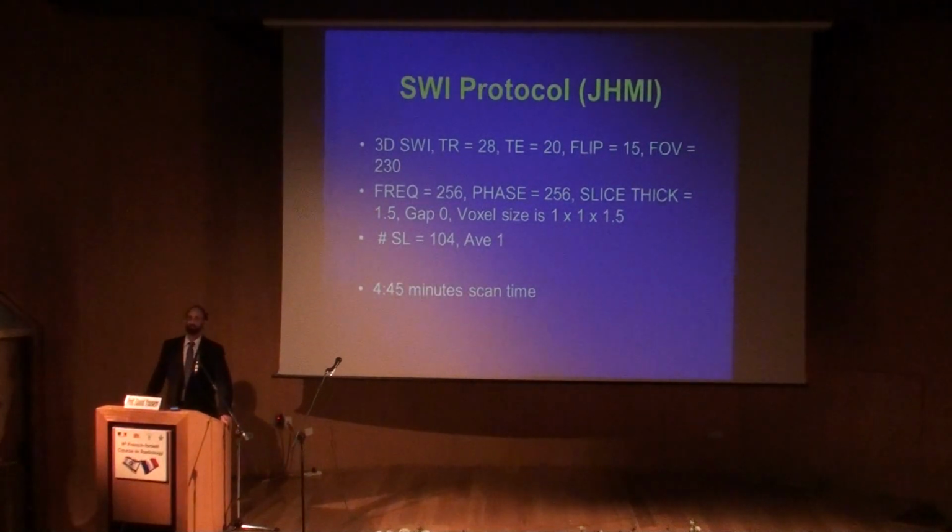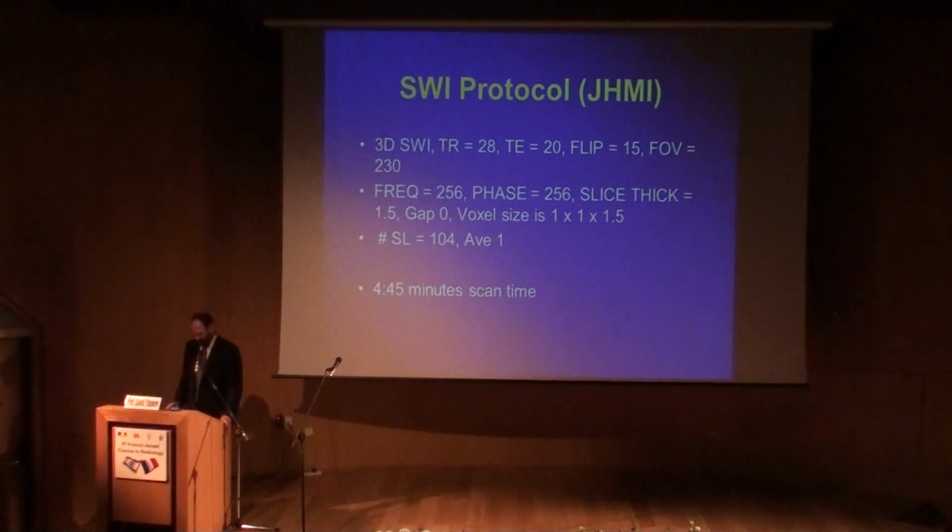When we do susceptibility-weighted imaging, it's a pulse sequence that does cost you in time. It's probably the longest pulse sequence that we have in our armamentarium. But as you will see, it is very valuable in selective settings that I will describe.